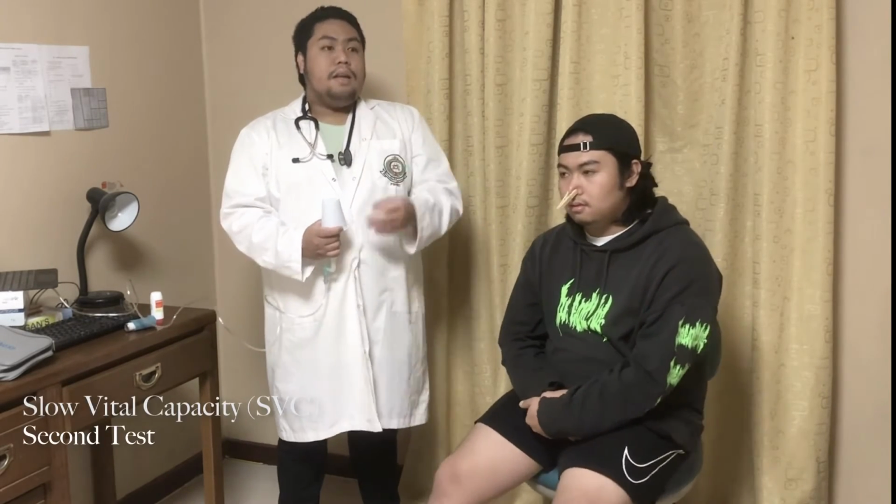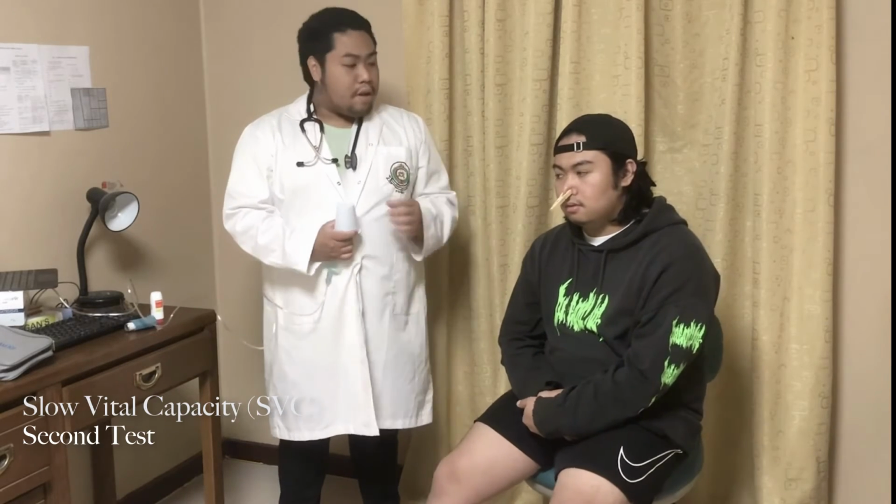Okay, make sure that your patient is feeling alright after the test, because their condition highly depends on it. With this test, as you see, we made the patient blow out as much air for 6 seconds. That might be tiring, but we need to obtain at least 3 tries. So basically, we're going to make him try again and again until he's tired, and then after that, we're going to take the best out of the 3. So that's it, sir, for your FVC test. Thank you very much, and now we're going to be doing your SVC and your MVV.